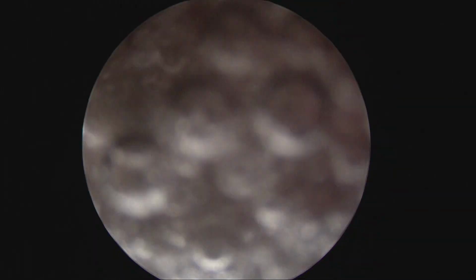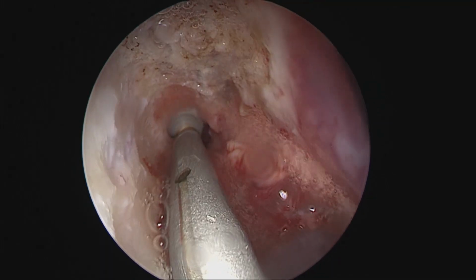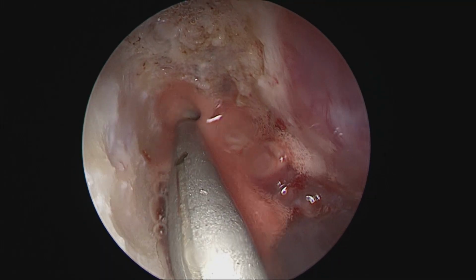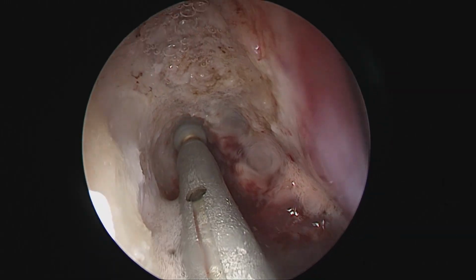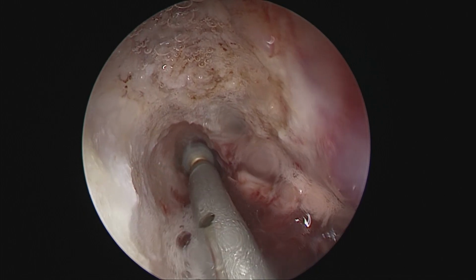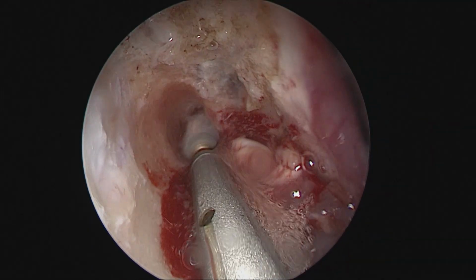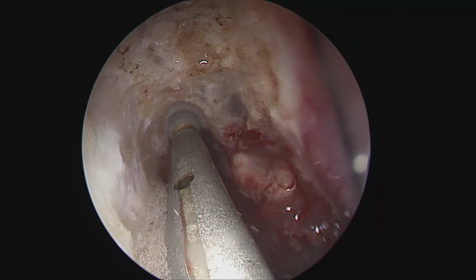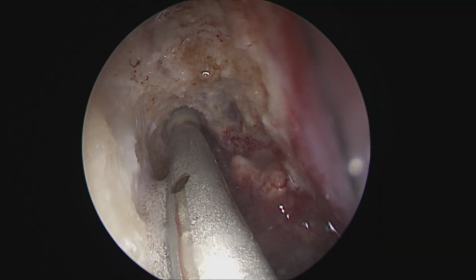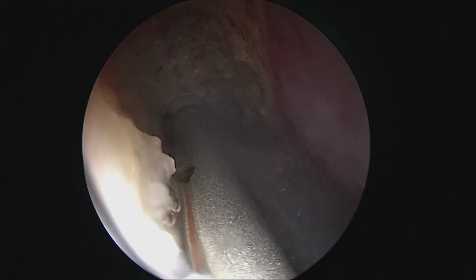So as we keep going, and give us some space, and then to engage our drill progressively to enlarge it in all directions, anteriorly, laterally, up to the skin, and of course medially we would do that till our nasal septum. Once you see that, it becomes progressively easier while we drill and locate our frontal sinus.